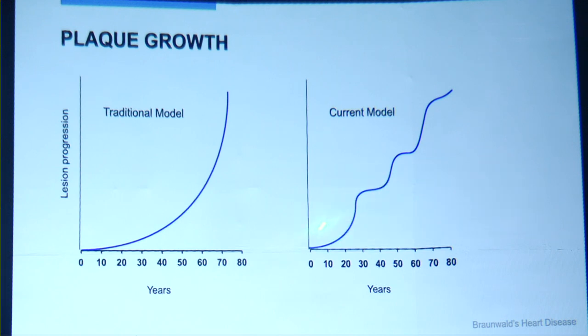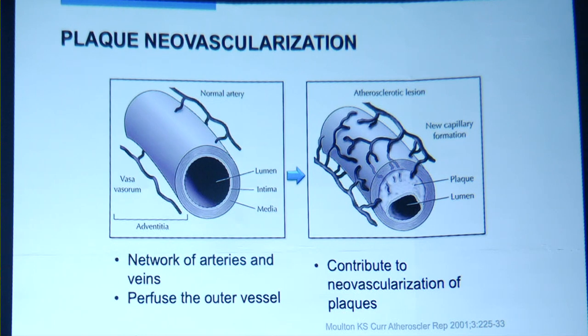And really, when you image perhaps down here, your IVUS or OCT identification may not find plaques that are going to progress 6 months from now. Very similar to why stress tests aren't that good at predicting long-term outcomes, because plaque development is a stepwise process. So bear that in mind as we use intravascular imaging for understanding plaque.